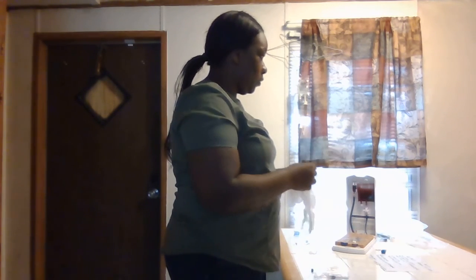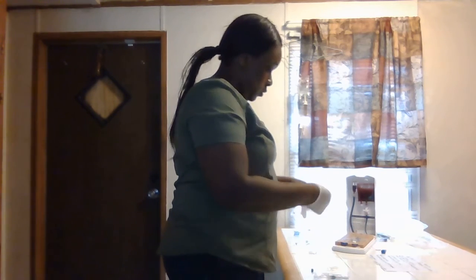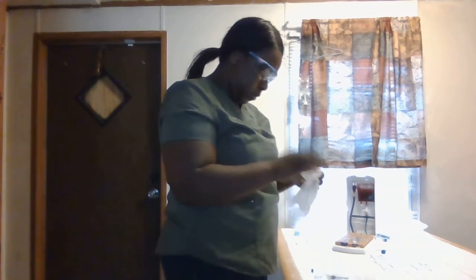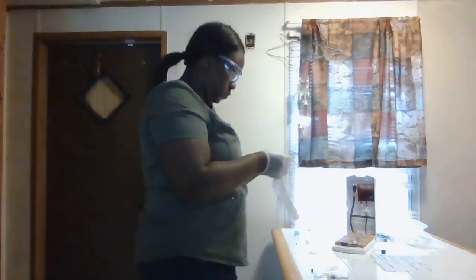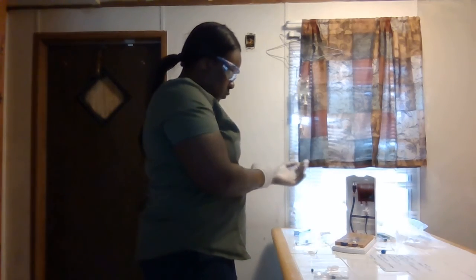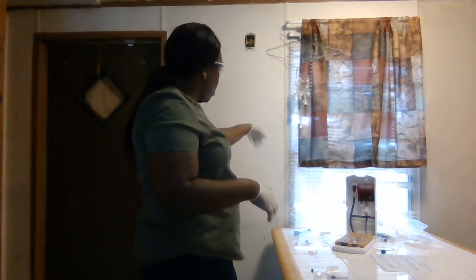Again, you gather your supplies, you put on your gloves and your goggles. I better put on my goggles first, then my gloves. Okay, got my gloves, my goggles. Always turn my pump off.